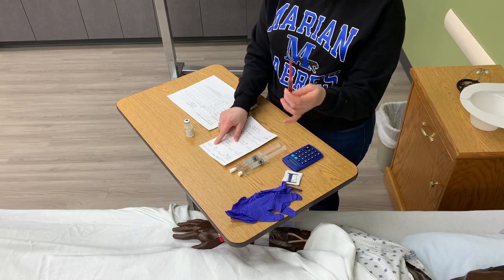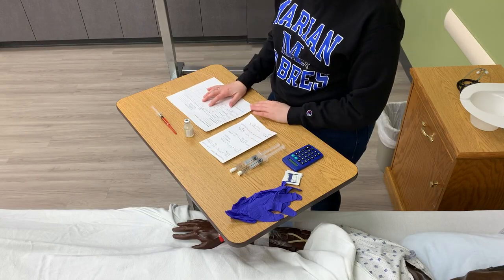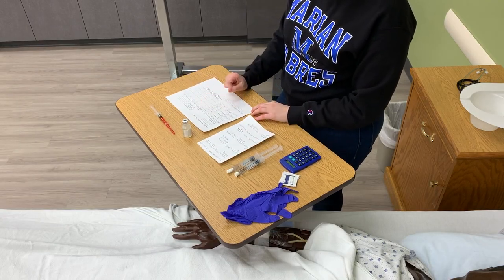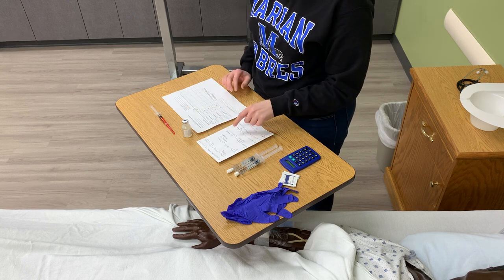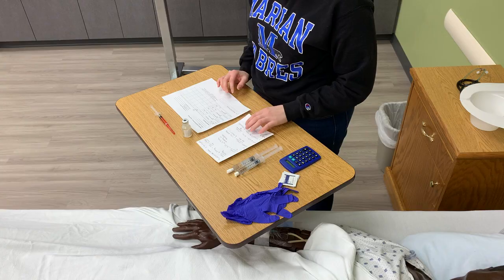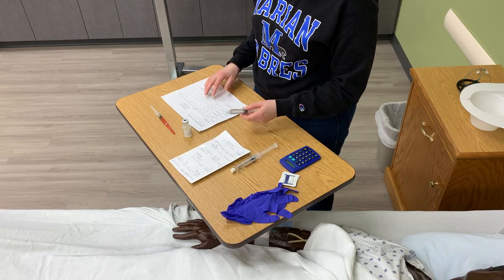And I'm checking that I have 2.5 mLs in my syringe, which I do. At 0900, it has not been given today. At that time, does not contain aspirin. It was not expired. And we have our calculations here. We're gonna give 0.3 mLs every 15 seconds. Gonna do MAR check 3 for my first flush.